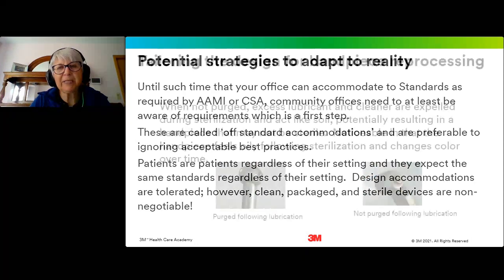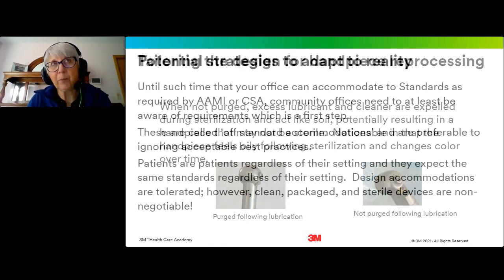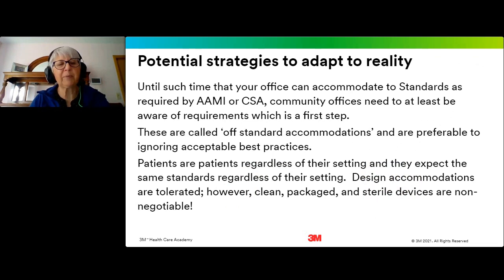With handpieces, so many people, for whatever reason, seem to think that as soon as you put your handpiece into the automated cleaner lubricant, the inside and the outside of the handpiece is clean. I don't know what would make people think that. There is no way that the outside is going to be clean unless your automated system allows for that. So you always have to clean the outside of your handpiece according to your manufacturer's instructions for use. And if there aren't any, you need to ask the manufacturer for help as to the best way to do that. Everything that you used, whether you're doing it manually, you generally cannot put a handpiece into an ultrasonic cleaner.